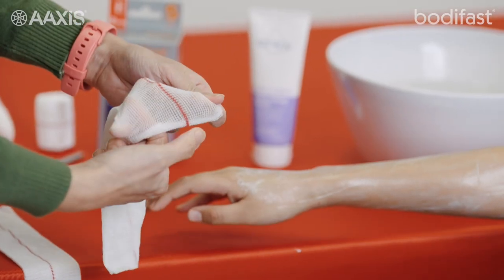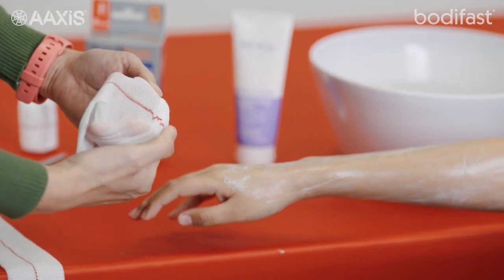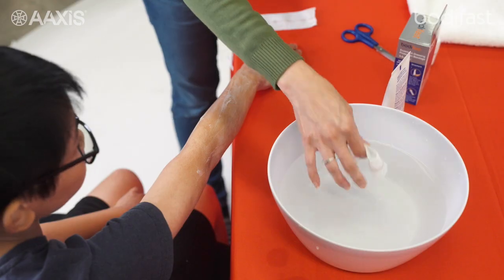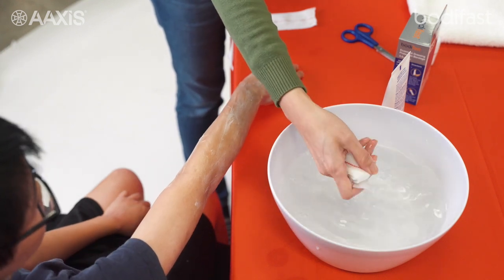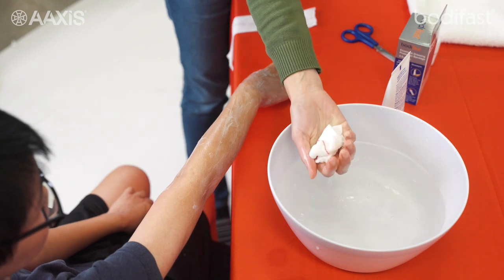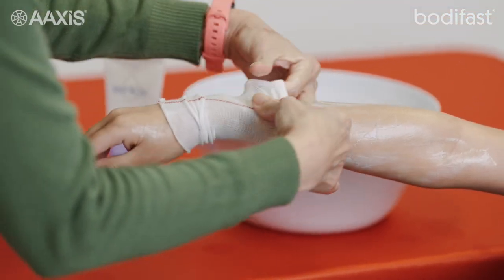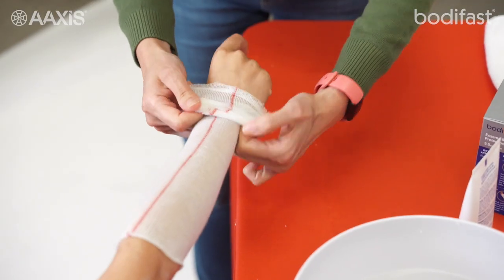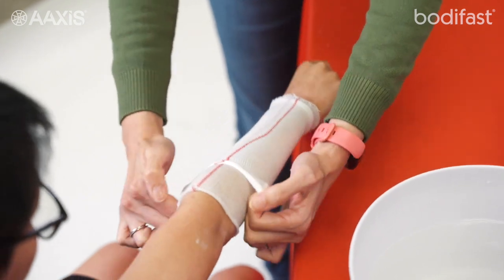They also have light elasticity for stretch to allow freedom of movement, but importantly, have no compression. Soak one layer of Bodyfast bandage in tepid water and wring it out gently. It should be quite damp, but not dripping. Apply the damp layer of bandage over the affected skin. Apply the second dry layer of Bodyfast bandage over the damp layer.